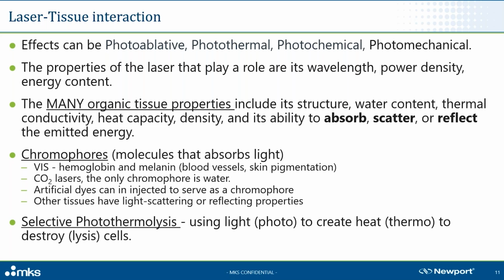Lasers come at various wavelengths, powers, and beam sizes and produce different effects in the body. And human tissue varies with even more factors. But essentially, laser light will either absorb, scatter, or reflect. And it turns out absorption is the most interesting factor. By knowing what tissues will absorb specific wavelengths, we can selectively target certain areas.